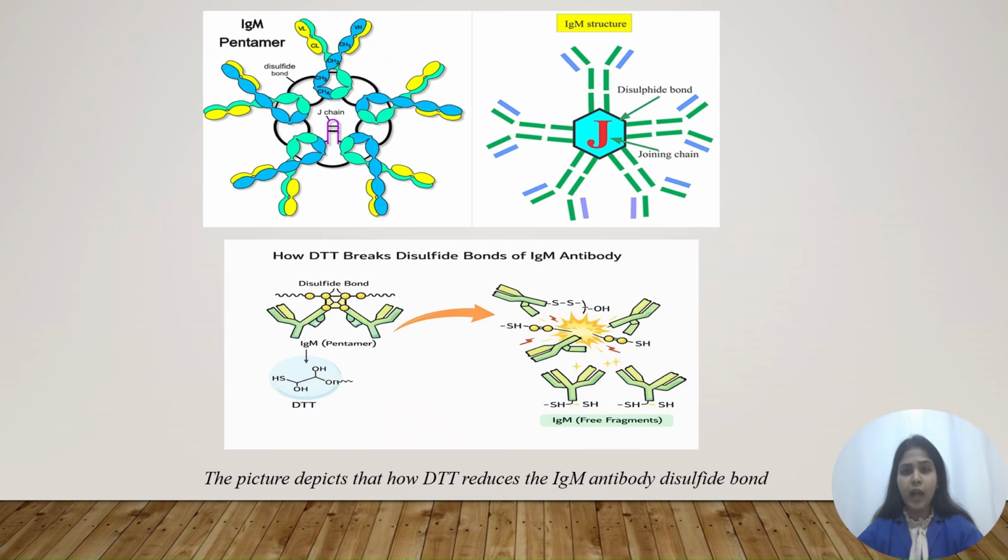But why are we ruling out the IgM? We are ruling out the IgM antibody as it is a naturally occurring antibody, or also an autoantibody, but it can strongly activate the complement that can cause false results. That is why we are ruling out the IgM antibody, and this allows us the specific detection of DSAs in the test.